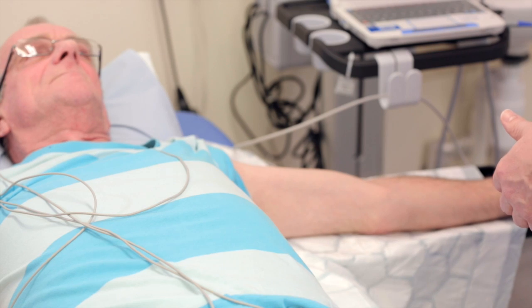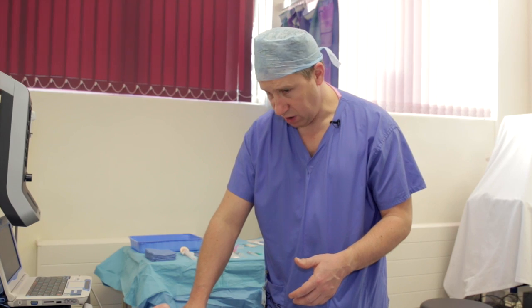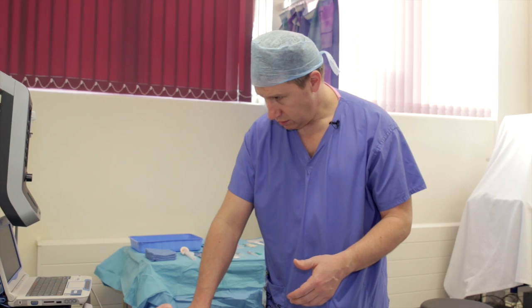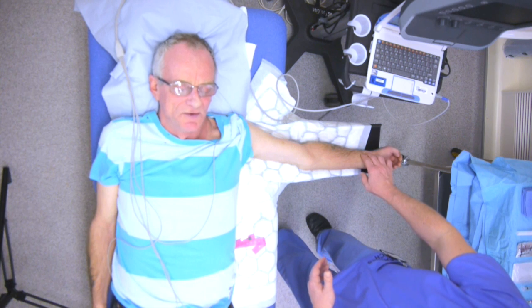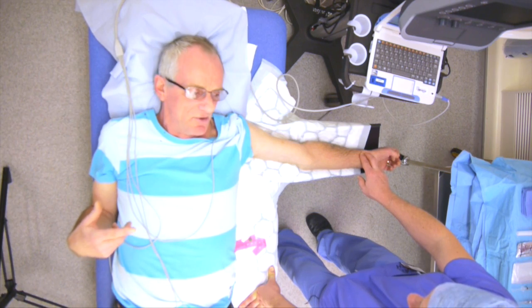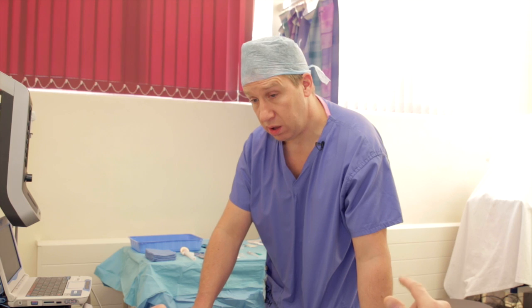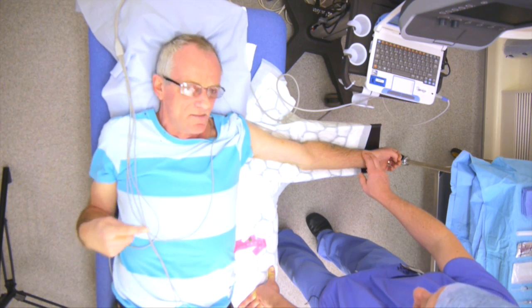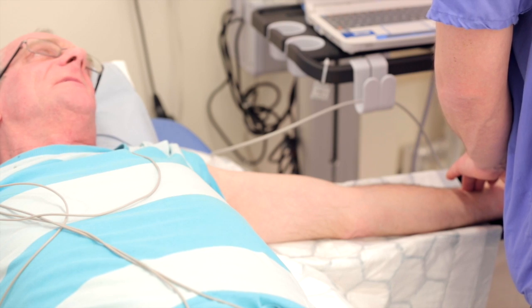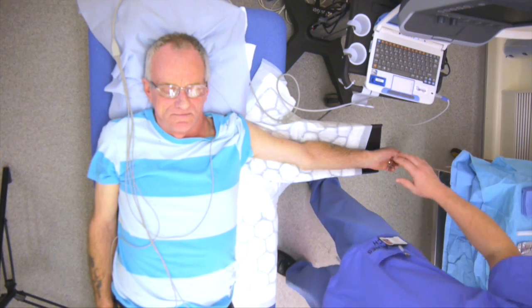Checking the patient's history: no pacemaker. The patient is taking bisoprolol — a beta blocker — as well as a cholesterol tablet, and has two stents. Bisoprolol will slow the heart rate, which is relevant for ECG interpretation during the procedure.